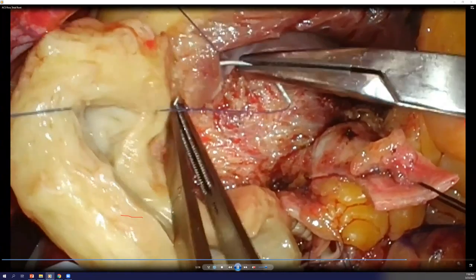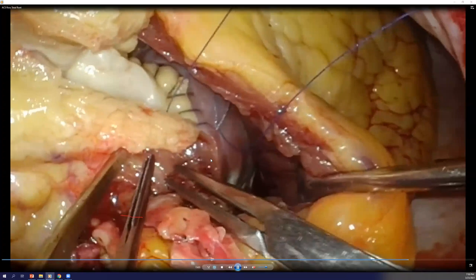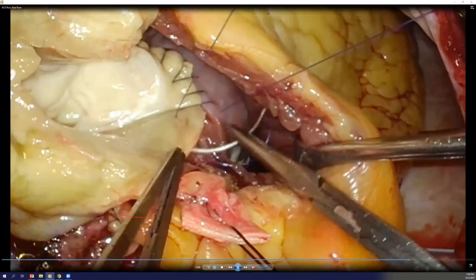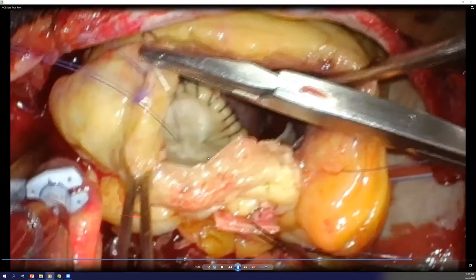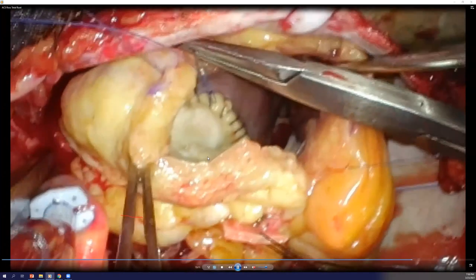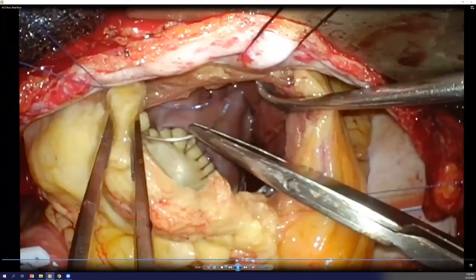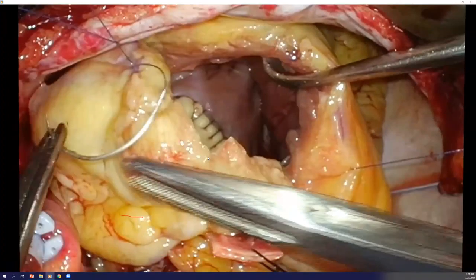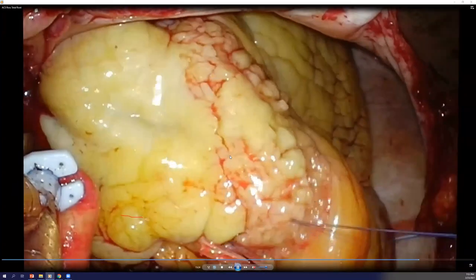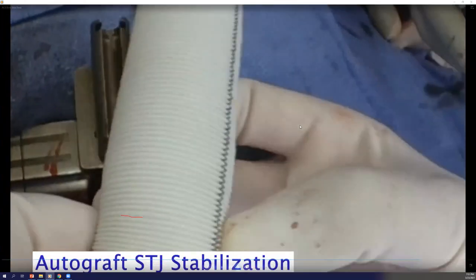They're almost partial thickness. And as you progress along the interventricular septum, the sutures can be thicker because there's really nothing to injure there. And then the anterior wall is very direct, just suture. There are no structures that can be injured when doing so. It's important to de-air the right ventricle before closing this. And the last step here, this patient had a 4.2 ascending aorta.